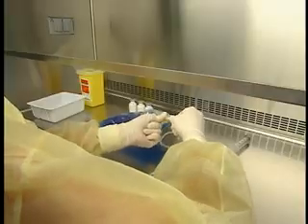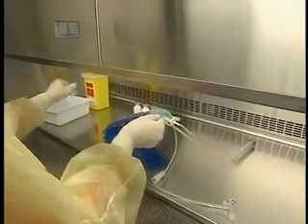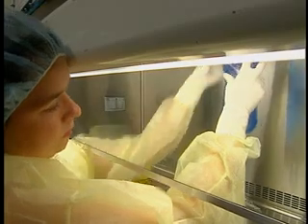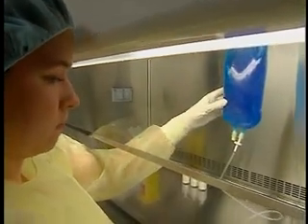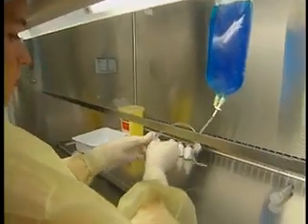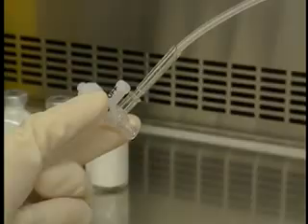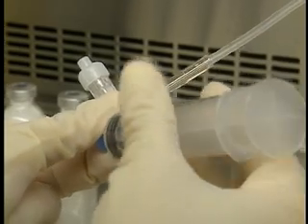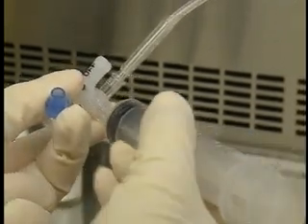Insert the spike in deeply, turning it as you push. Hang the bag in the center of the hood. Remove the cap from the multiple-way valve and keep it between your fingers. Take the syringe in your other hand. With the tip of the syringe facing the valve, remove the cap and keep it between your fingers. Attach the syringe to the valve.